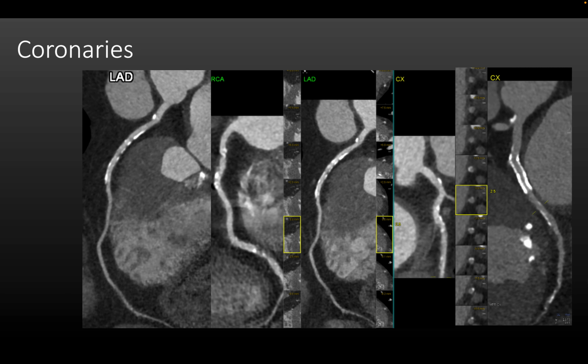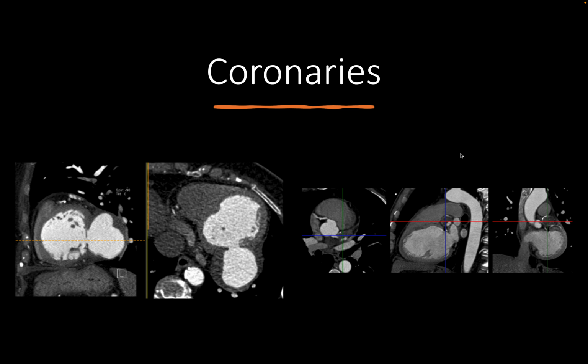And also after the management, with the improvement in the resolution, after putting a stent, we could see inside the stent if there is re-stenosis, in-stent stenosis, material break of the stent, migration, or under-inflation of the stents. Of course, it will depend on the material of the stent. So the picture quality will depend on the material and the size of the stent. If it's below 3 millimeters, then it would make the assessment very difficult.